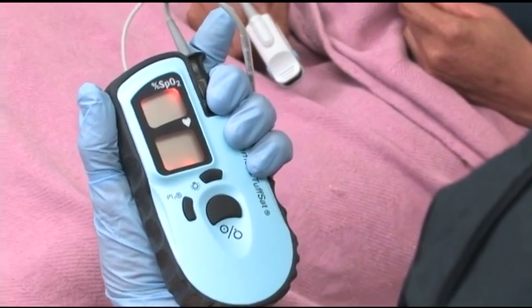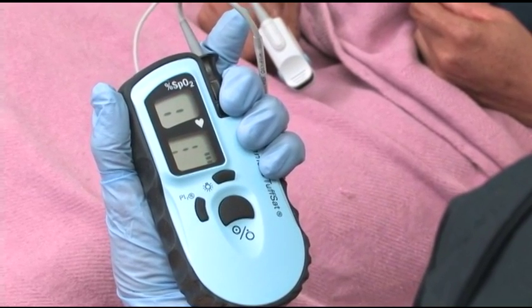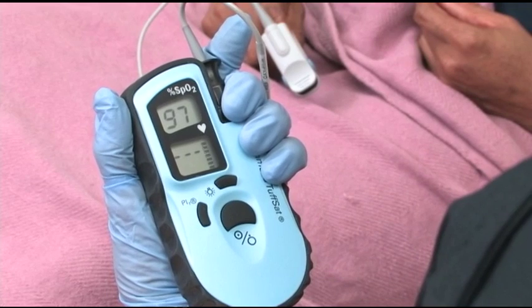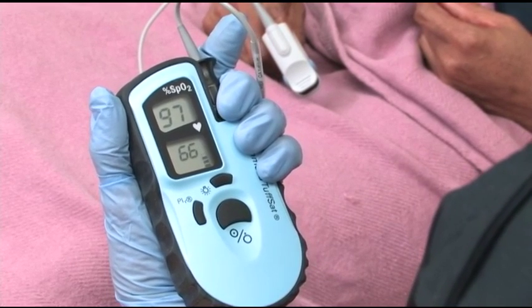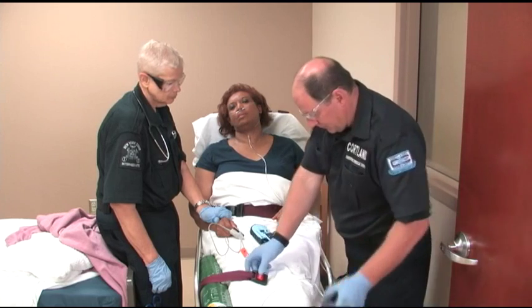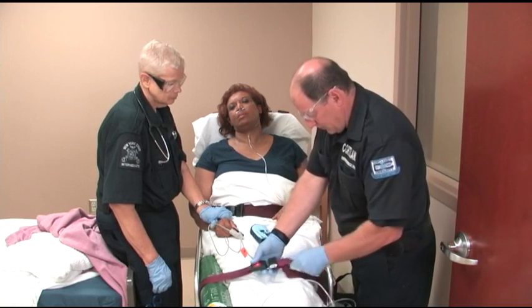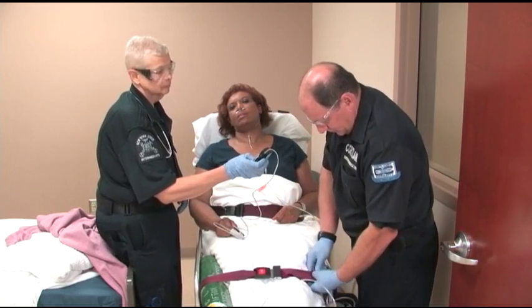Make sure the heart rate displayed on the monitor screen is the same as the patient's pulse rate, which you palpated already. Some pulse oximeters may display a pulsatile waveform, which should correspond with the patient's pulse rate. Once you get an accurate reading, check the oximeter reading periodically. A convenient time to do this is when you check your patient's vital signs.